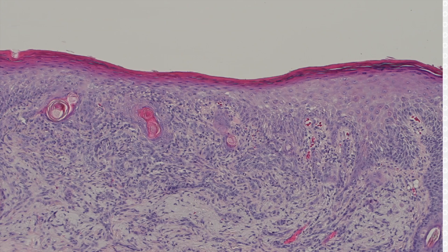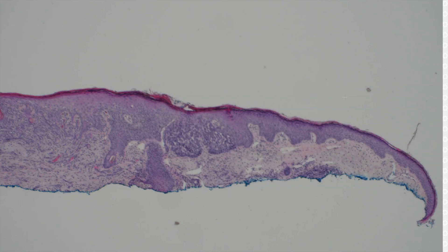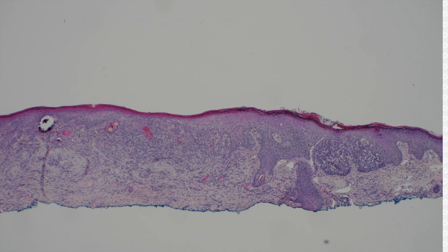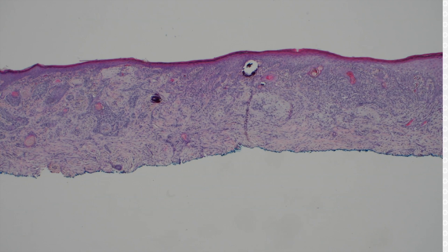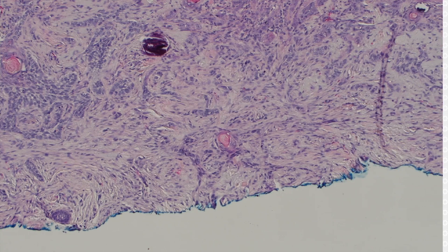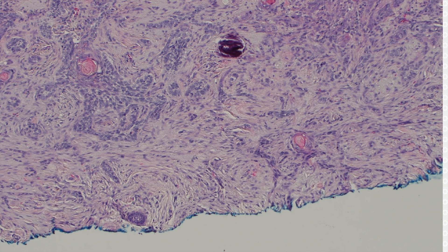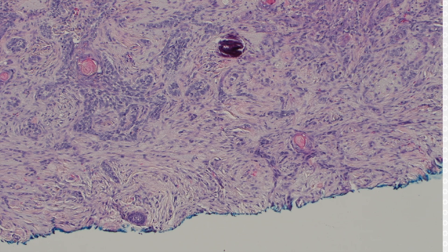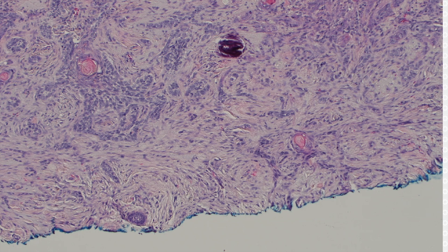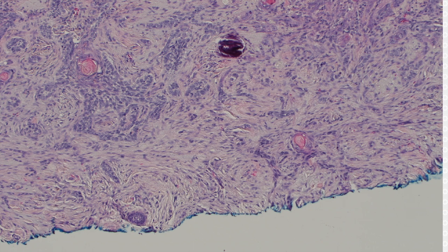What helps here is this — look, we've got some obvious superficial basal over here. You could have basal colliding with some other tumor, but when you see merging of obvious basal into these little infiltrative cords, and look how cellular and very busy the stroma is. The stroma of infiltrative basal is a bit different than the stroma of the other paisley-tie things, like syringoma, desmoplastic trichoepithelioma, and MAC. They all tend to have very dense pink sclerotic stroma, whereas in infiltrative basals, it's often a bit more fibroblast-rich.